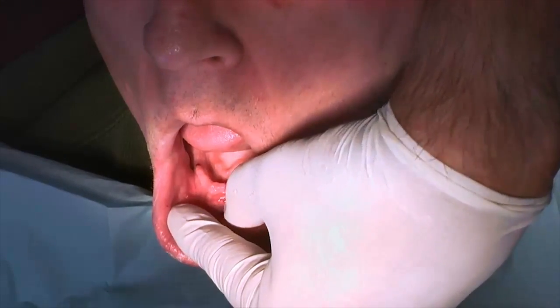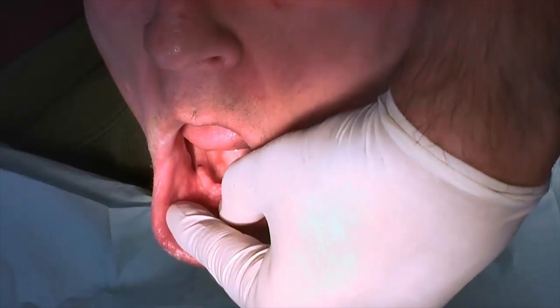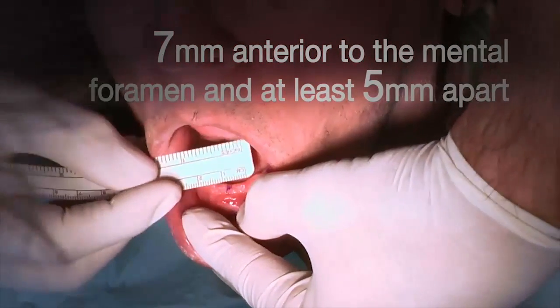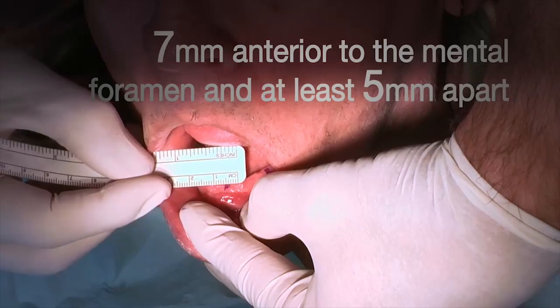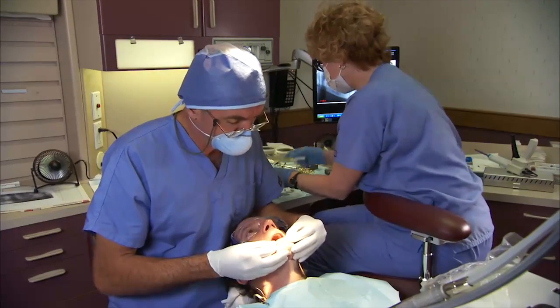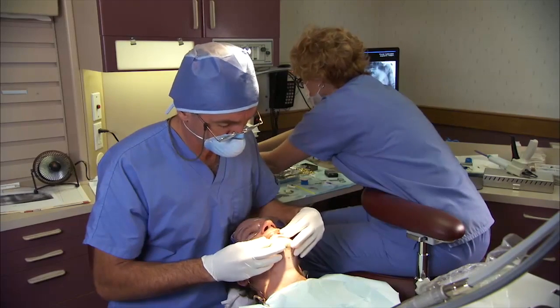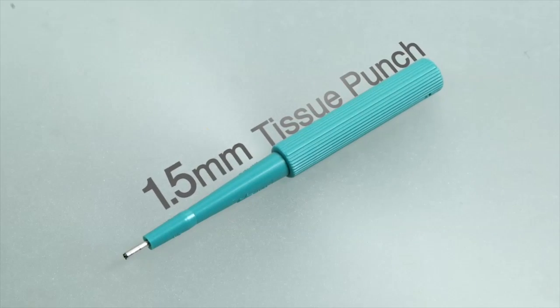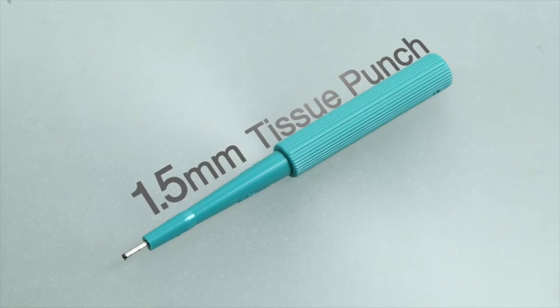Use caution to orient each implant to the planned location in the mandible — 7 mm anterior to the mental foramen and at least 5 mm apart. If desired, or if mobile mucosa is present at your proposed implant site, use the 1.5 mm tissue punch to remove tissue and gain access to the bone.